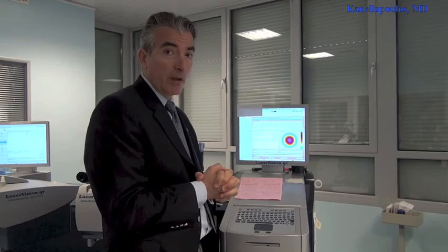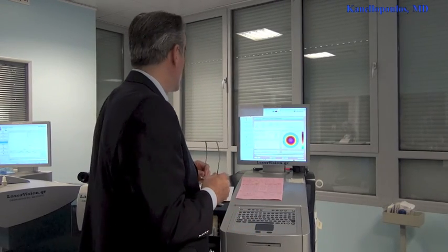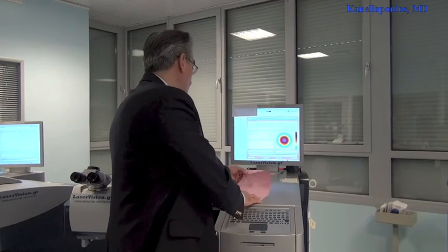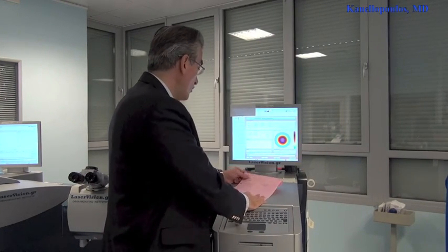I'll try today and explain to you our protocol in treating myopes with the topography-guided platform by Wavelight Alcon. It's called Contura these days with a new launch. And we have a typical myope here, a 38-year-old male.